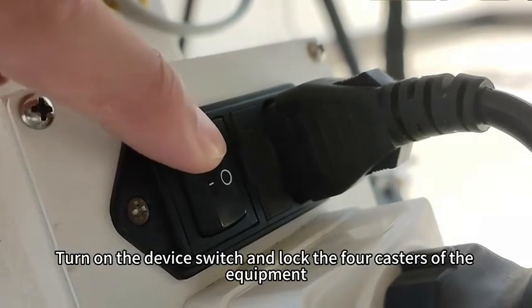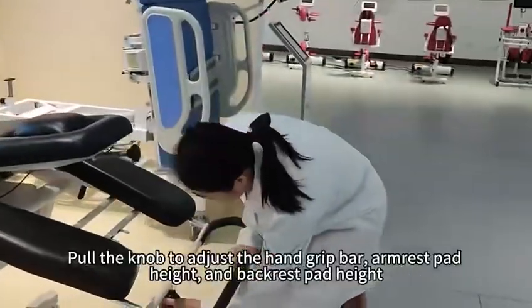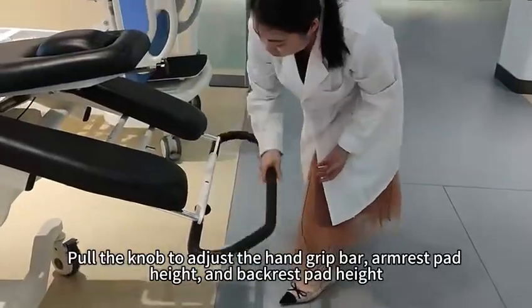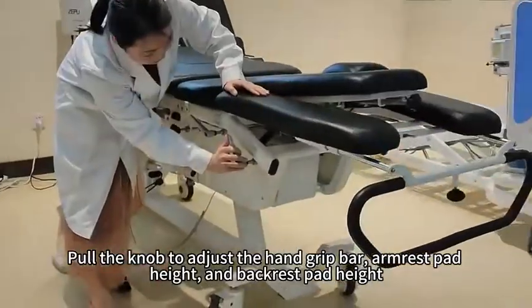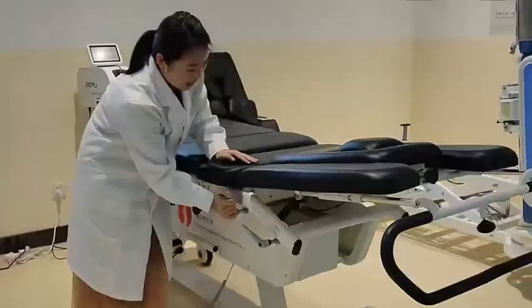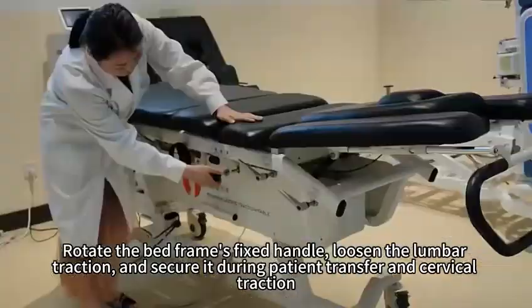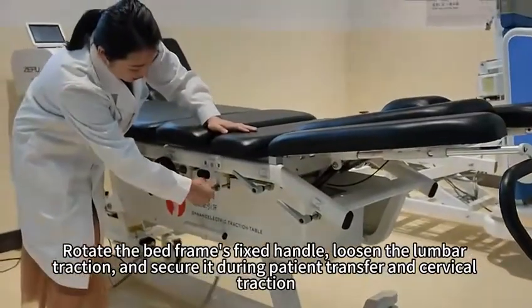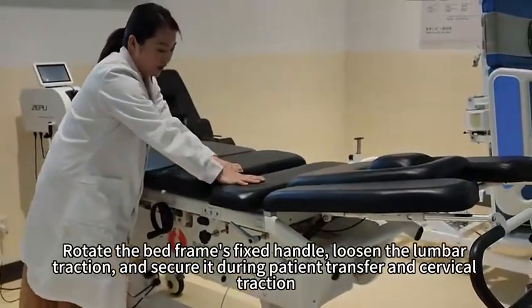Turn on the device switch and lock the four casters of the equipment. Pull the knob to adjust the hand grip bar, armrest pad height, and backrest pad height. Rotate the bed frame's fixed handle, loosen the lumbar traction, and secure it during patient transfer and cervical traction.